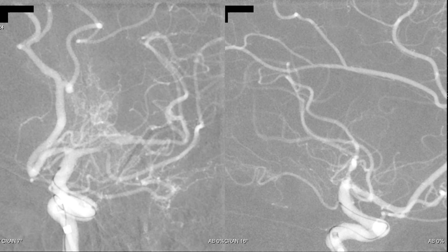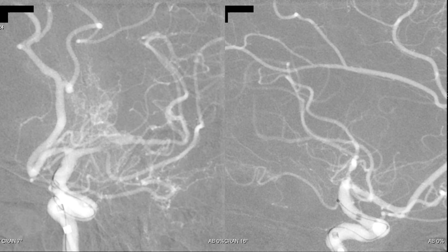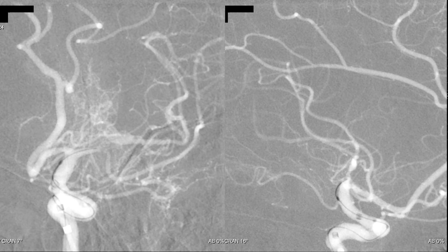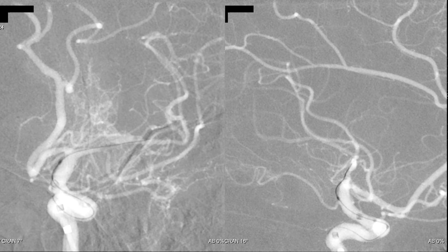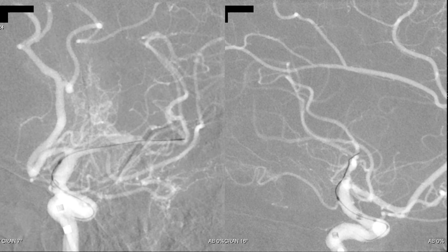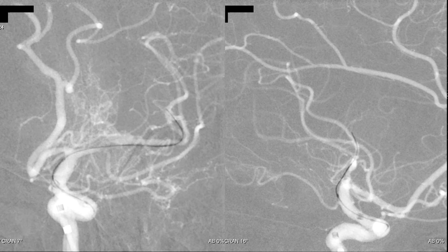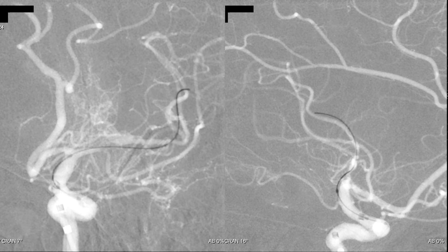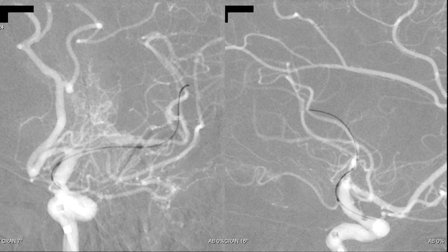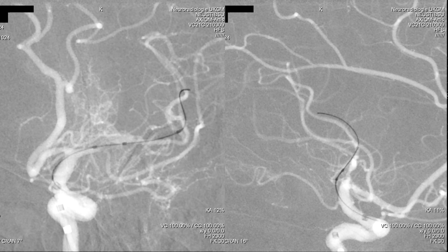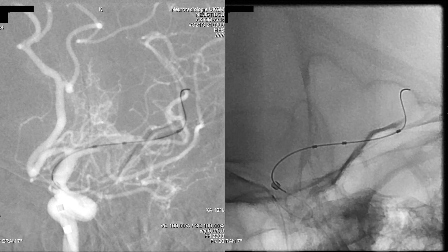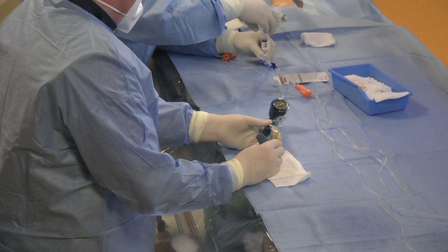Before we navigate the stenosis, we bring the intermediate catheter a little bit distally so that we have a very good base. Now we are navigating the stenosis and here we are passing through it. We are now at the distal parts of the M1 and M2 segment of the left MCA. With the micro wire in a stable position, we push the balloon catheter to reach the stenosis. The first distal marker is the tip of the microcatheter, and the following two markers are the balloon markers. Here we have the inflator.